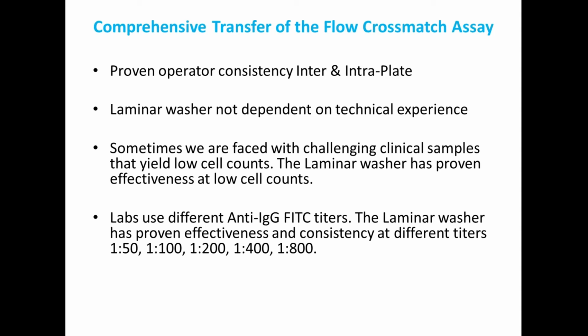And then I performed a FITC titration experiment to determine whether a lab could continue to use our current FITC dilution of 1 to 400 when using the Laminar Wash system. I also trained my newest tech, who only has 1 year of lab experience, to plate a crossmatch using the Laminar Wash system. I remember Dr. Prabhakar's previous webinar on a Laminar Wash system that showed there was minimal variation of test results from tech to tech and from test run to test run, and between replicate wells. Technology transfer between operators can affect our process and our precision.